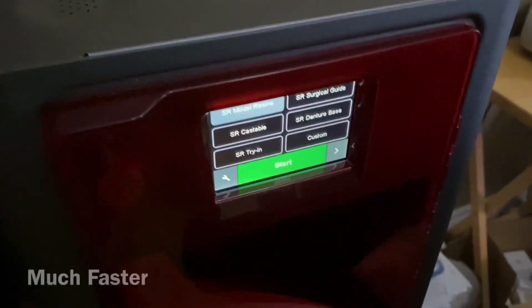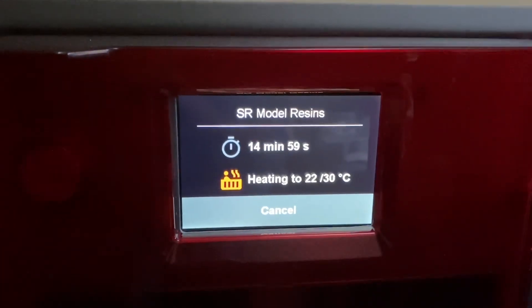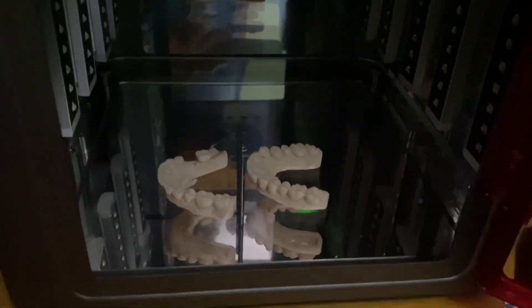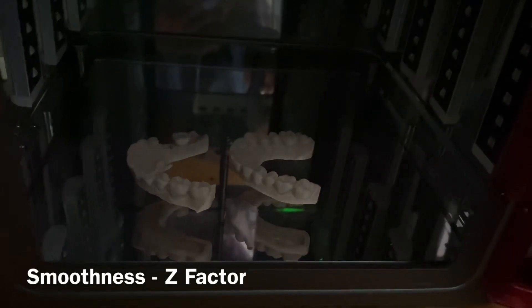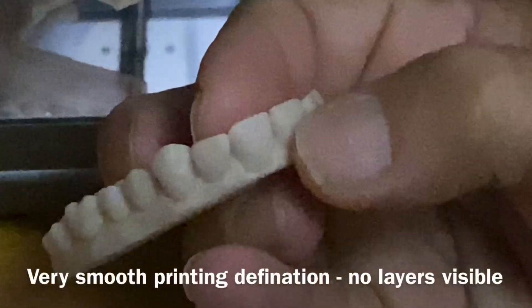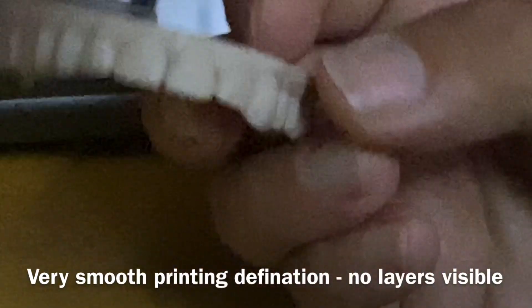It works relatively the same as the other printer but it's a much faster unit. Once it's gone through that process it's done - you just take it out. We've got something already in there cooking. You can see inside there are a couple of models we printed. How are you finding the smoothness, or what they call the Z factor - the print up and down? They're very smooth. Even to the touch - if you feel that with your fingers it is smooth, there's no abrasive feel at all.